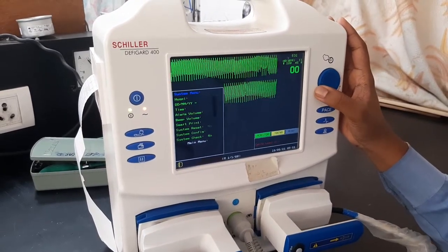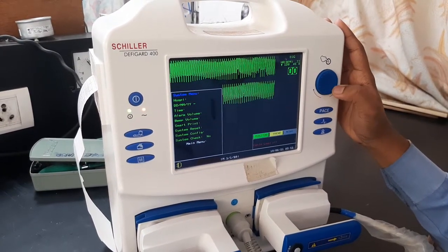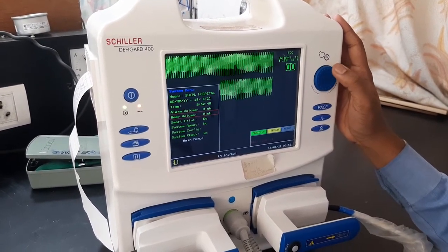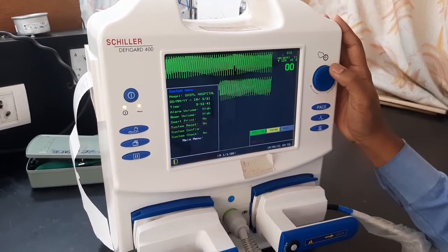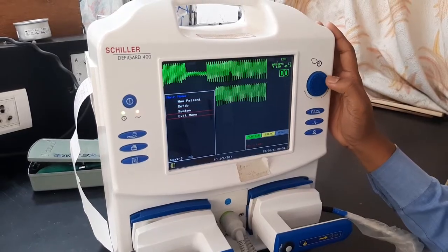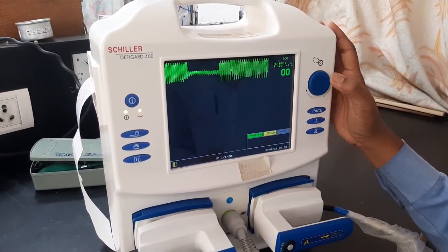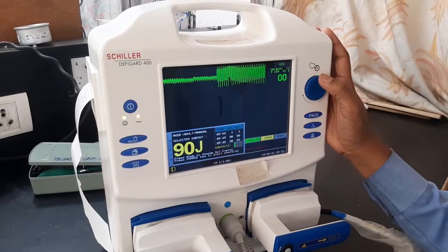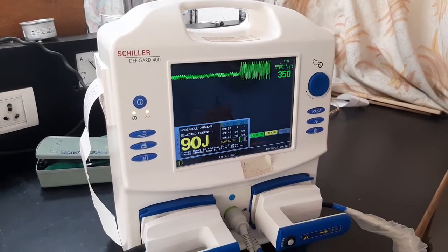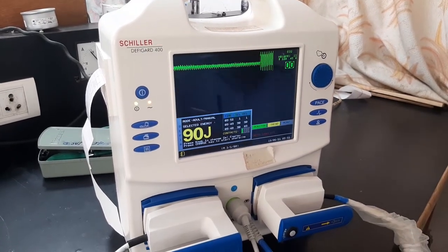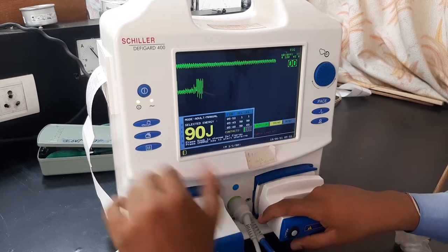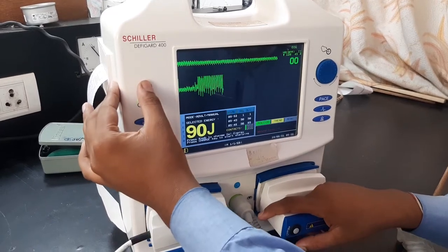To exit from the menu, go to main menu and select exit. The next parameter to understand is shock delivery — when you are going to deliver shock to the patient.